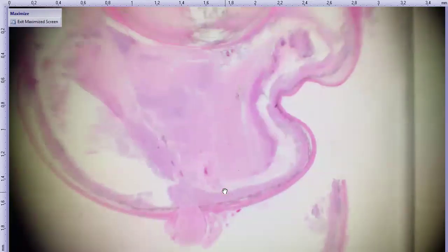Okay, here's the subgross. So lots of proteinaceous exudate in the anterior chamber. We've got the cornea, the lens, iris, and ciliary body, and you can see that most of the inflammation is centered on the posterior aspect of the eye. This is a pattern that I think is important to recognize, of chorioretinitis, vitritis and endophthalmitis, right?